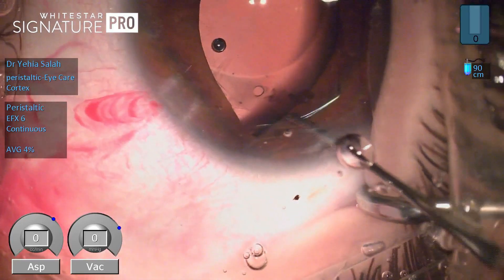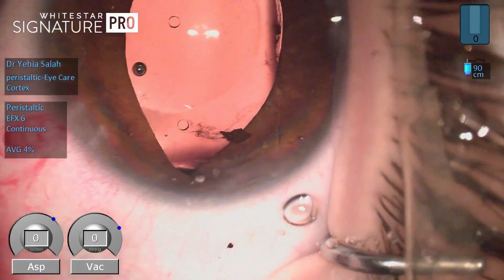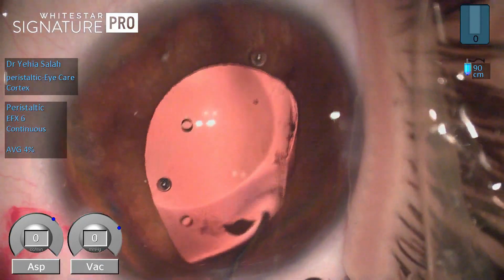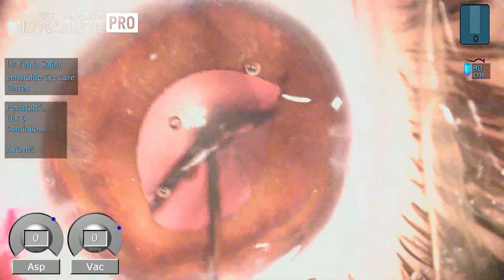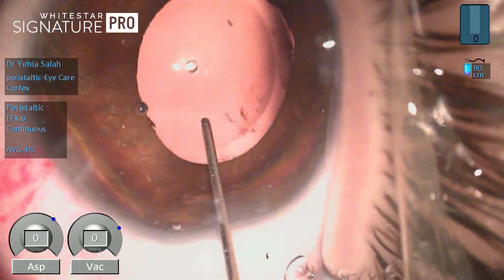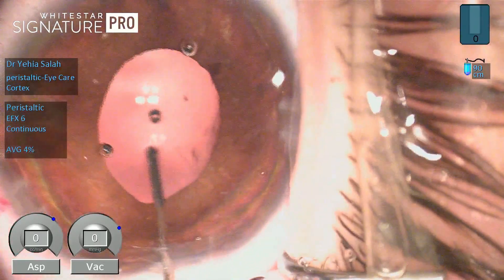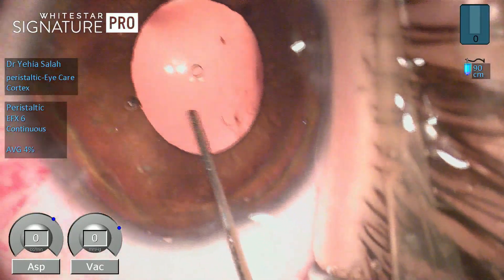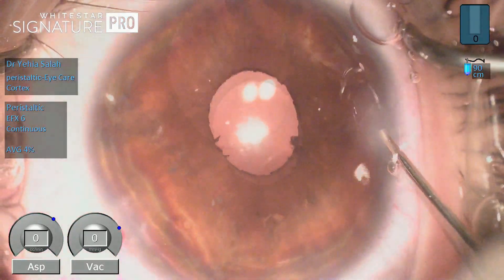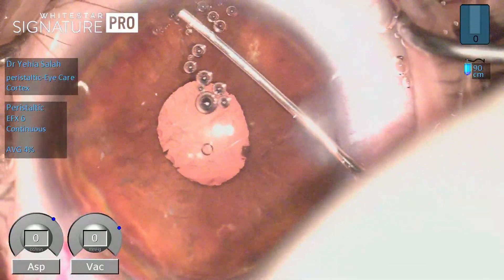Once the ICL is placed back into the posterior chamber in front of the crystalline lens, I make sure to rotate it to the proper orientation — usually horizontal at the 180-degree meridian, which is where we size the lens by measuring the horizontal white-to-white.